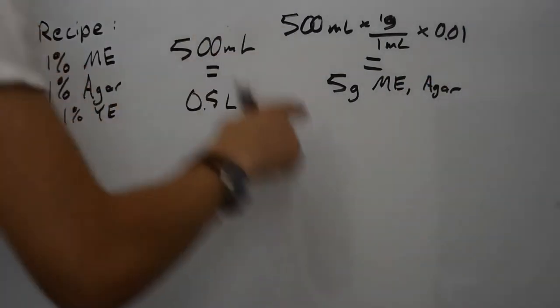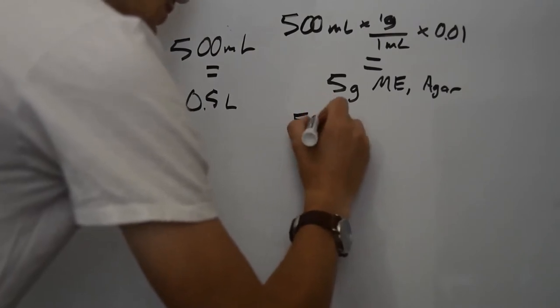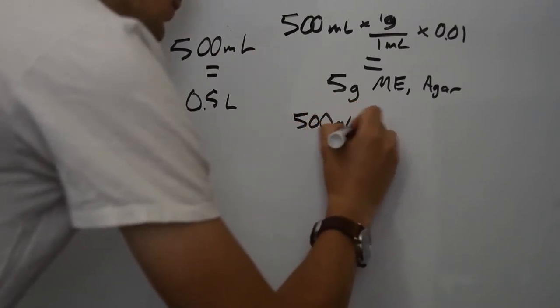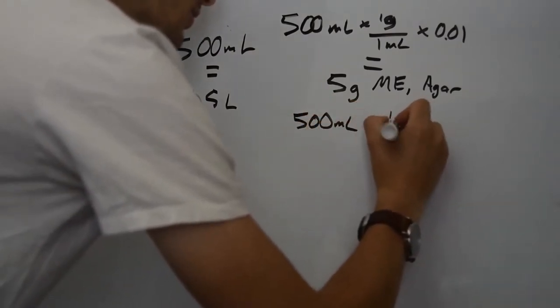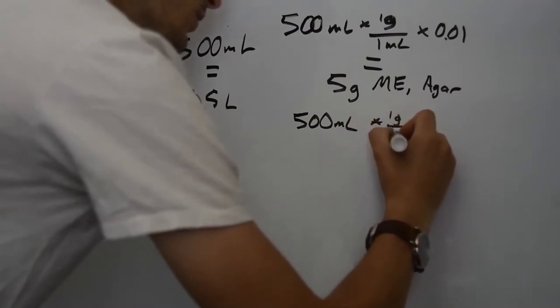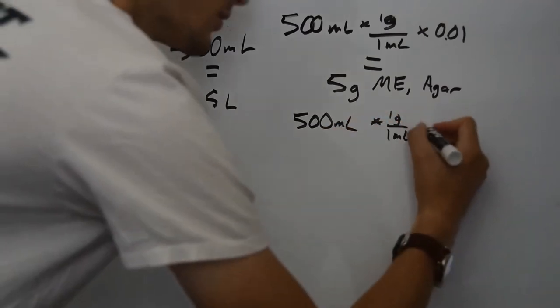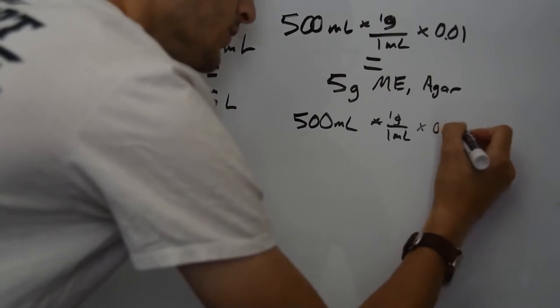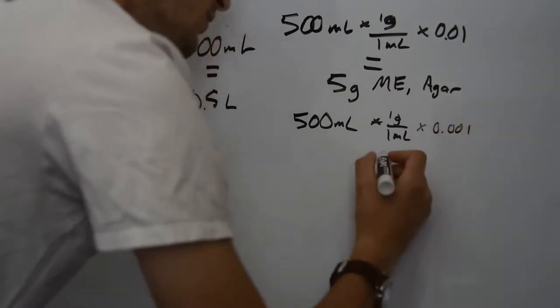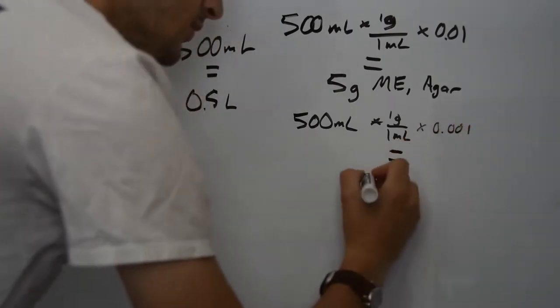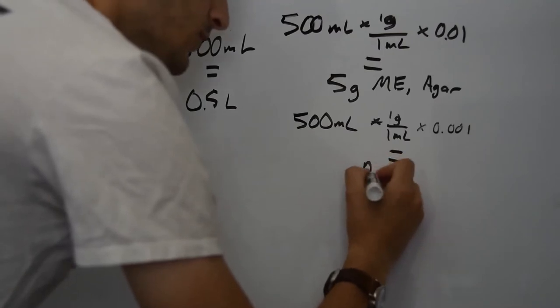We can use the same conversion for the yeast extract but by multiplying by a different proportion. This gives us 0.5 grams of yeast extract.